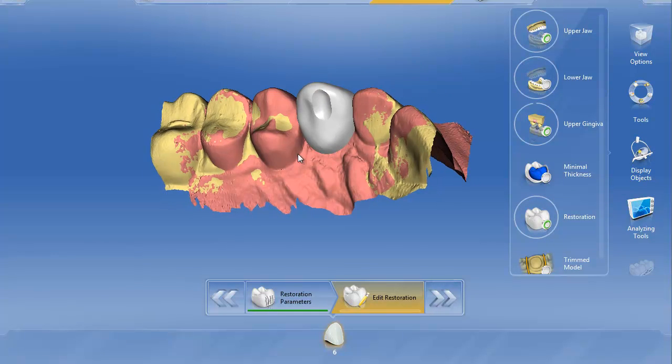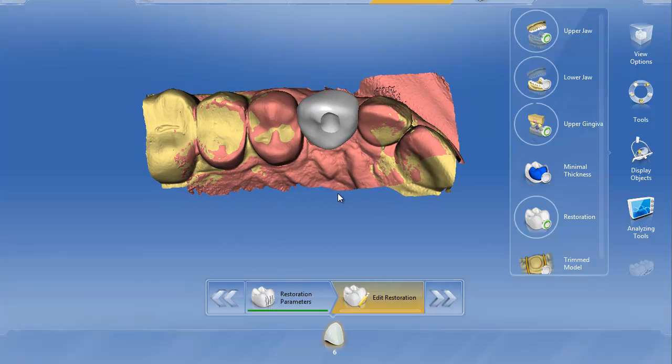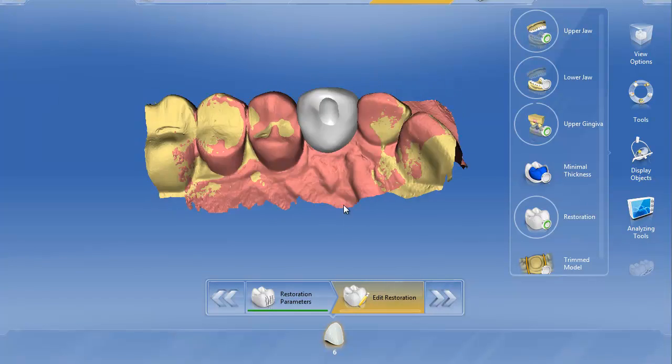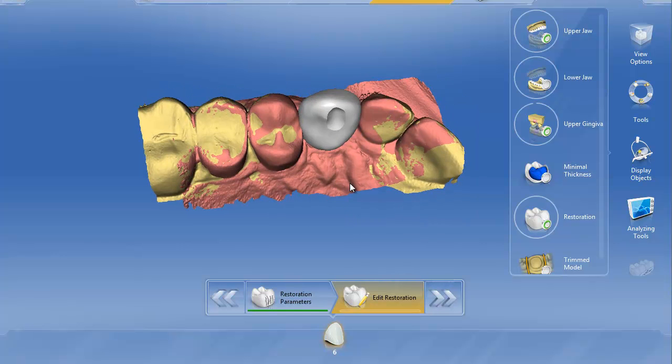And now you've got a very sharp, demarcated line where to finish your screw access hole with a burr after you mill the restoration. I like this method a lot better than the two directional shape tool because the two directional shape tool tends to affect the surrounding area a little bit too much. This only affects the area where you demarcated in the circular area.